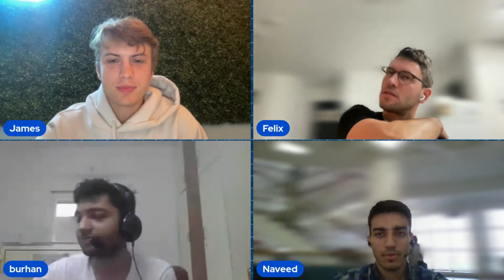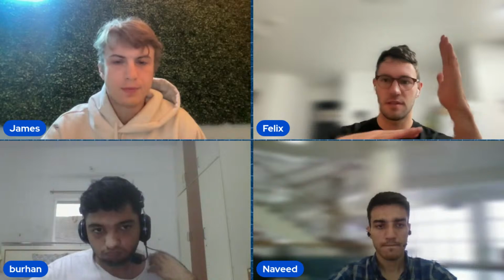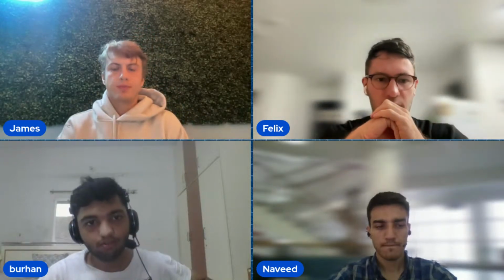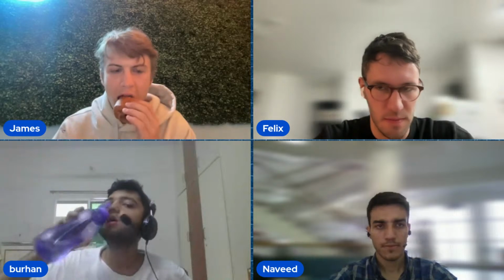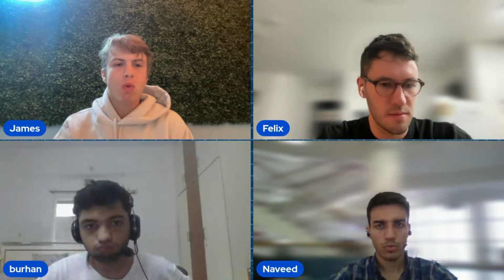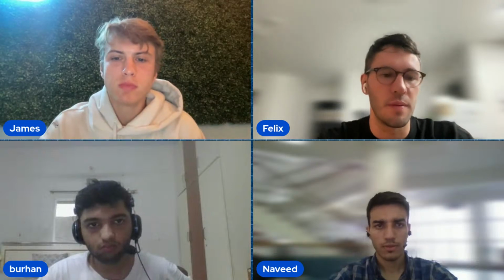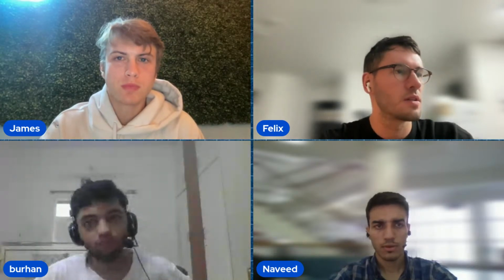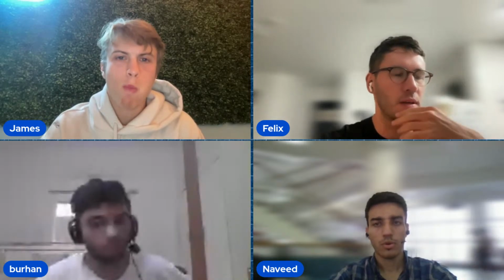I have a question. When you pre-process those images, why do you have this X and Y axis? Is that something that you ask for in the pre-processing? What are you talking about? In the images that Burhan just showed, there was this X and Y axis, kind of framing the image.